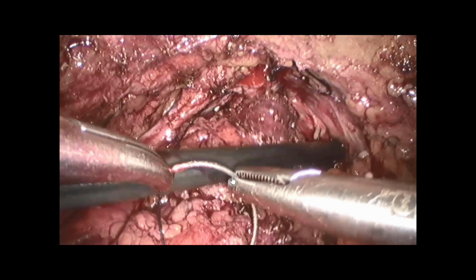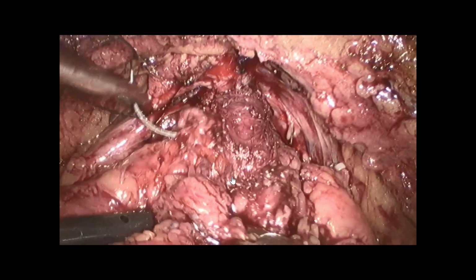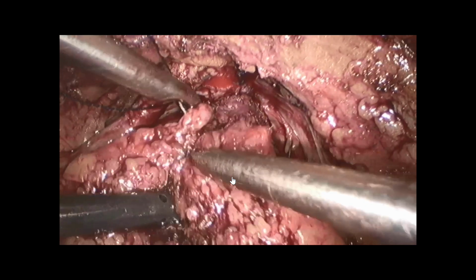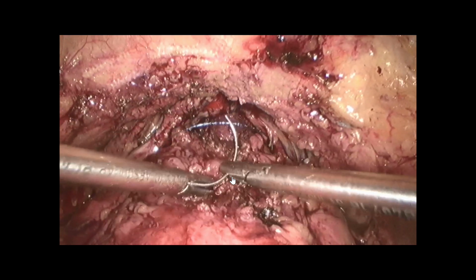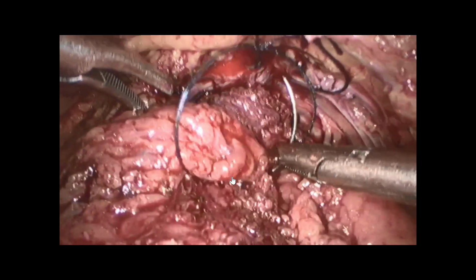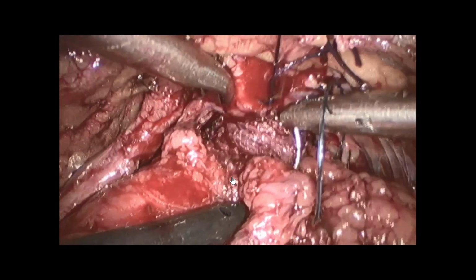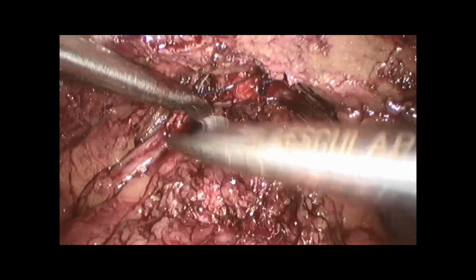We'll test, always I test, and also I wash the bladder. Pay attention to this. Sometimes you have some clots in the bladder, and sometimes in the recovery room, they call you, the patient is in retention because he has clots, and then it breaks everything. So just always pay attention to this.